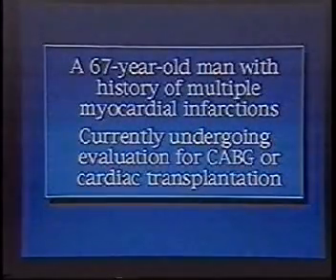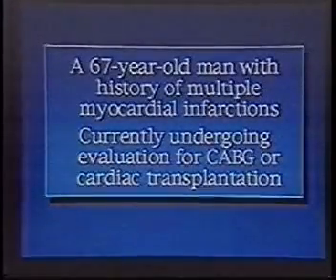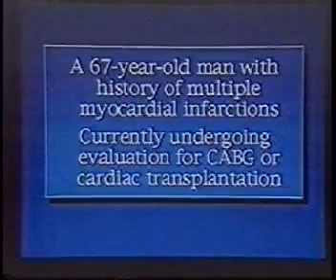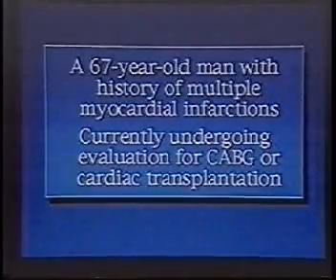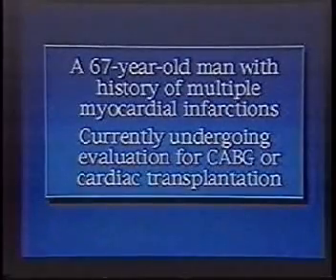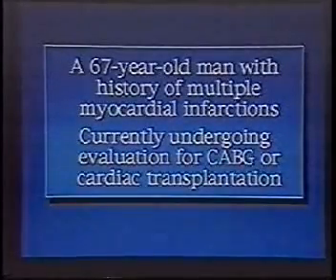So, a different case. Well, one thing I want to talk about is the perfusion. Why do MR instead of nuclear medicine? Well, one of the things is MR tends to perform a little bit better than SPECT nuclear medicine, like thallium imaging, thallium or sestamibi imaging. It's similar to the performance of PET in terms of sensitivity and specificity, but better than SPECT. And if the SPECT is of good quality, of high quality, then MR probably isn't going to add much. But there are certain patients who have a moderate quality SPECT, especially if they have soft tissue overlying or other artifacts, in which case an MR may be beneficial in those types of patients where the SPECT is not of the highest quality.